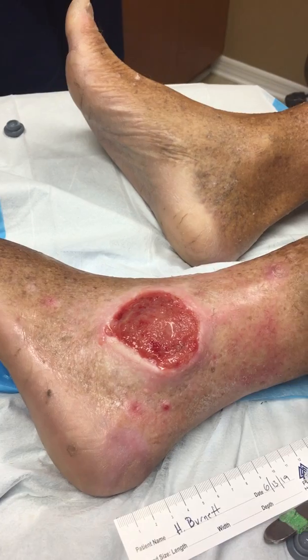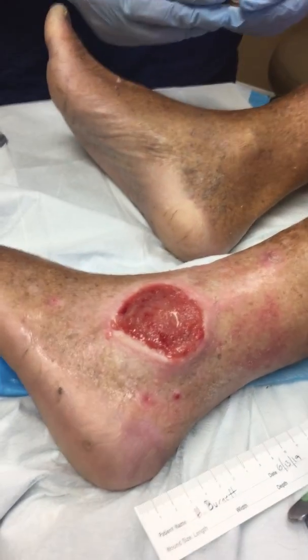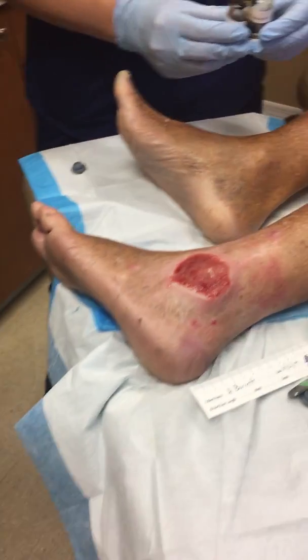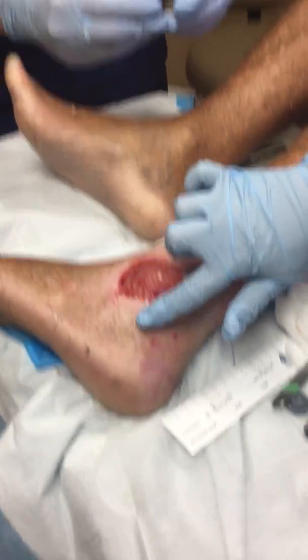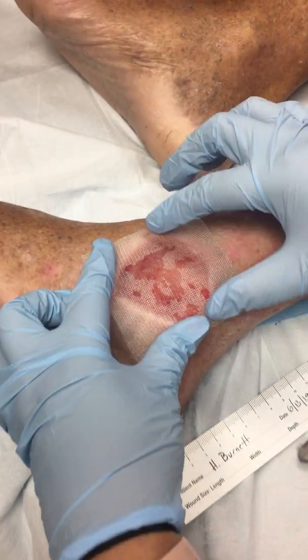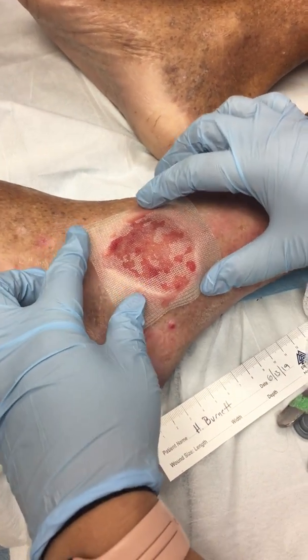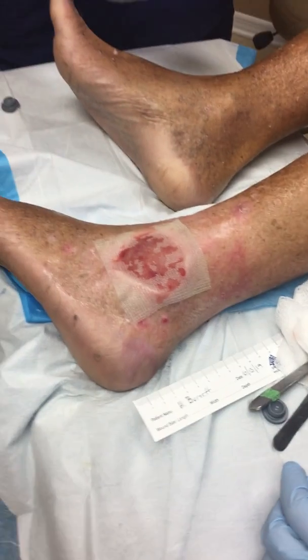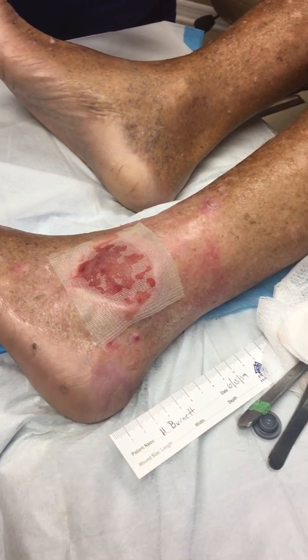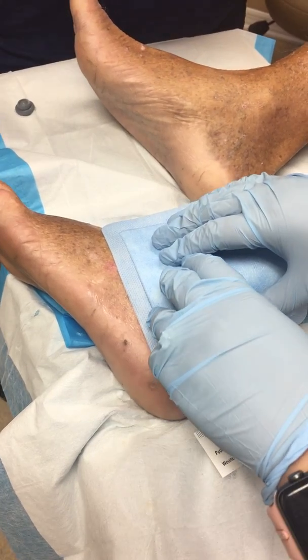I'm going to hold this for a second. We are going to cover it with Adaptic, let that sit there for a little bit, then cover it with an extra layer of dressing, and then a Curl-X. Alright, I'm going to stop the video there.